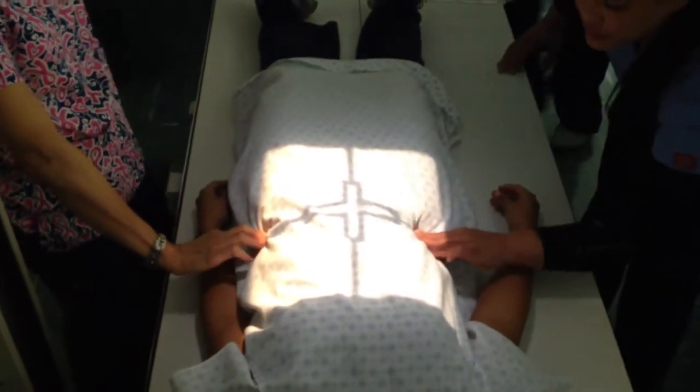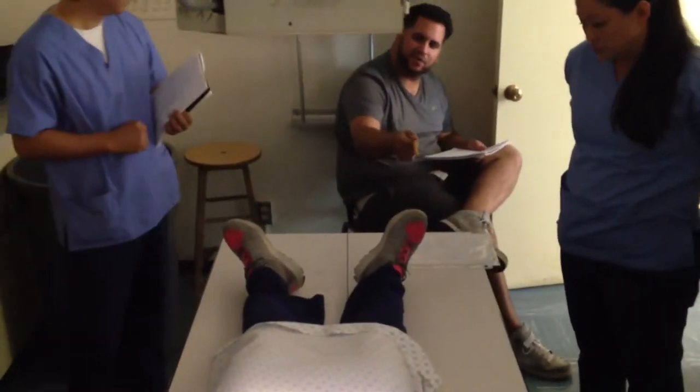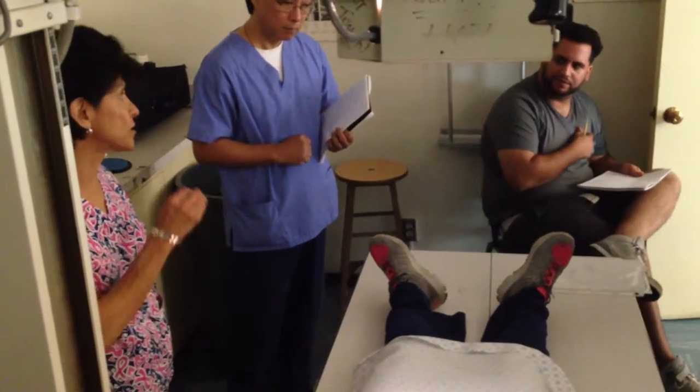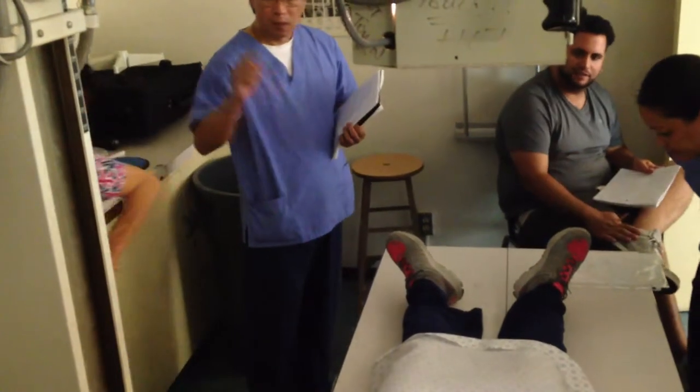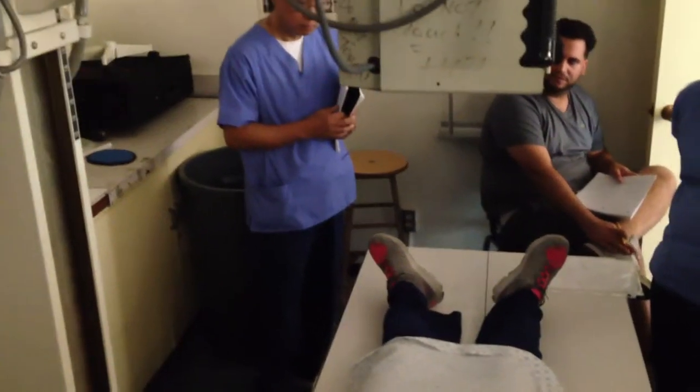So this is our first one. Don't be afraid — if you look at it and say, 'I might cut off the fundus,' then slide her down a little bit. Because this should have fundus and a little bit of small bowel. So the first one's an abdomen. You're saying going a little higher than a normal abdomen? Yeah, she wants to make sure. You need the fundus. Three to four fingers above crest, for sure.